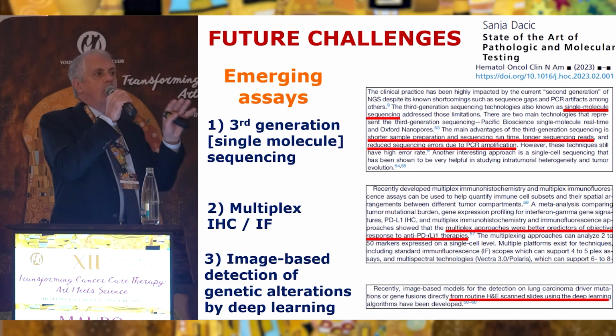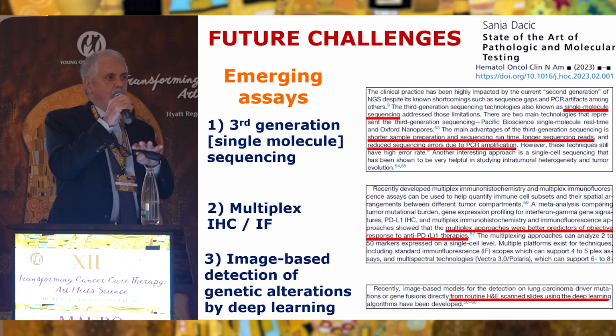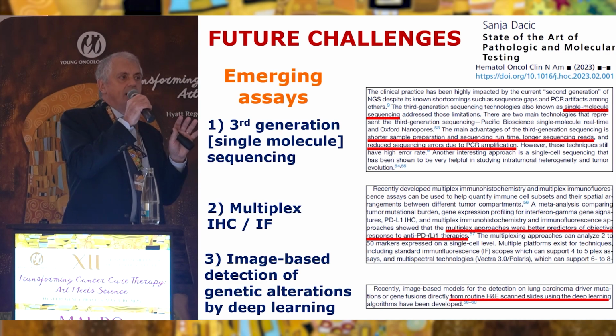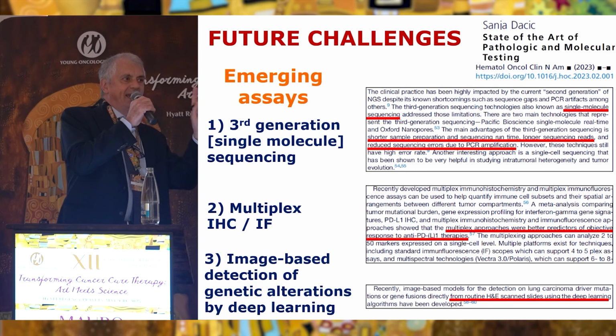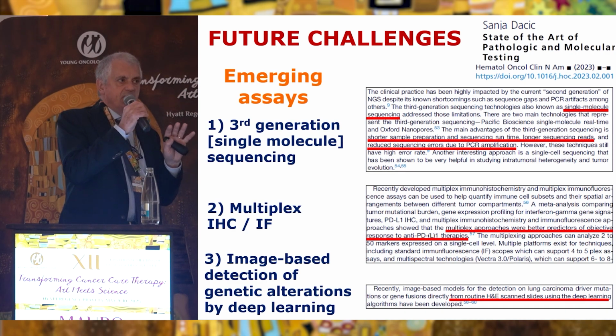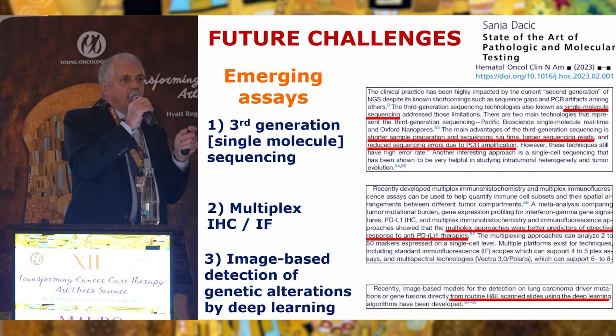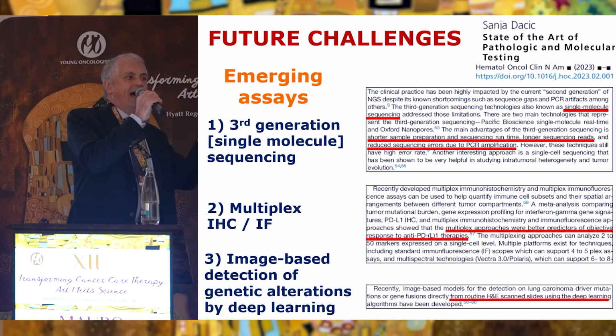So adenocarcinoma, squamous, neuroendocrine, like that. Some prognostic markers can be counted by the machine, PDL1, Ki67, these things can be done. Rare tumors, no. And eventually the machine will not be able upfront to decide if the tissue is okay or not, if it is viable cells or not.